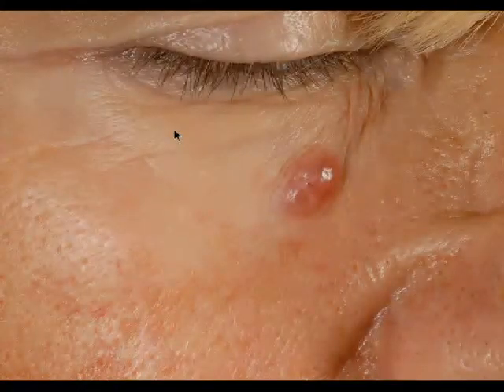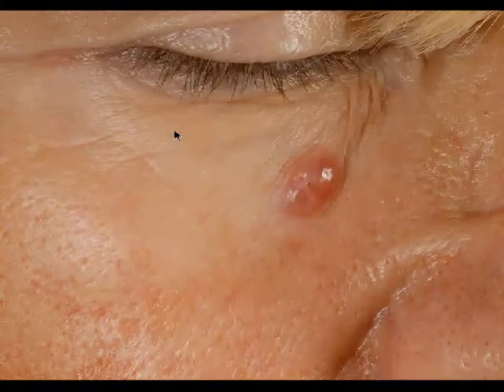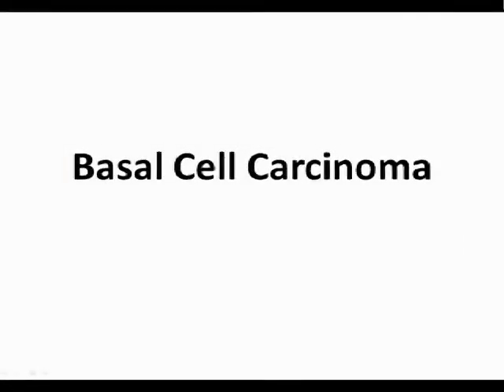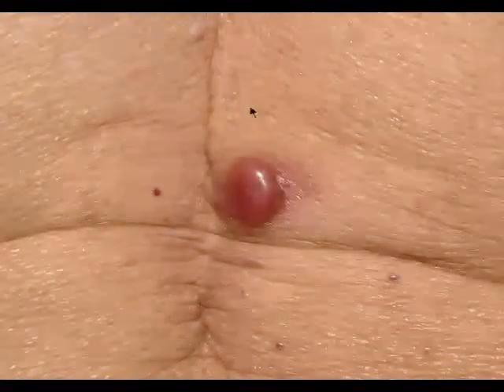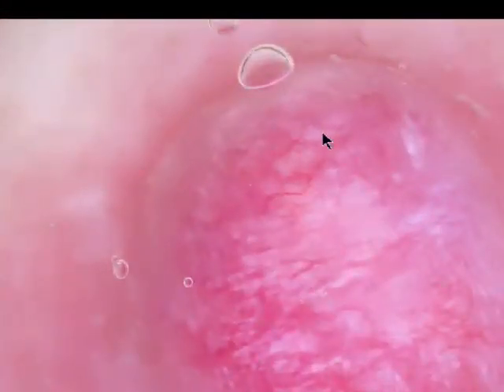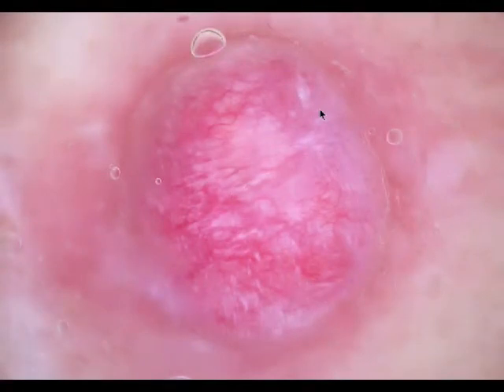Now some nodules, clinically easy, again, basal cell carcinoma, and this is confirmed dermatoscopically. Which type of vessels do you see? Well, they are linear and they are serpentine. They are multiple bands, and some of them are branched, so the arrangement is branched, so the diagnosis is basal cell carcinoma. This was easy. Another nodule here, clinically and dermatoscopically, the same pattern of vessels, serpentine, branched vessels. They're a bit out of focus, not so sharp, demarcated as shown in the examples before, and some white lines. White lines are not specific, but may indicate a malignant process.